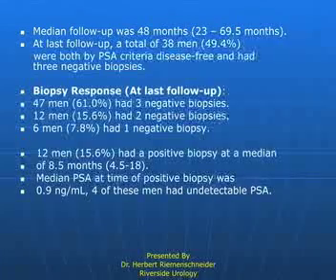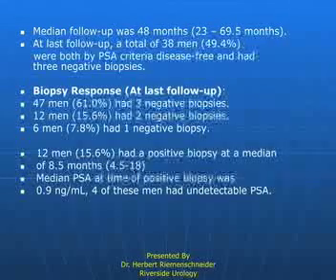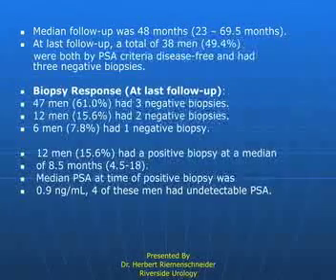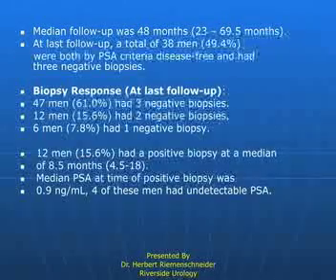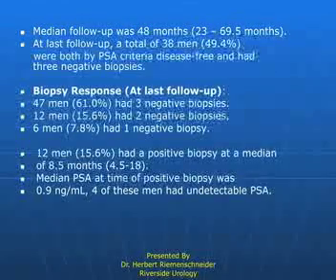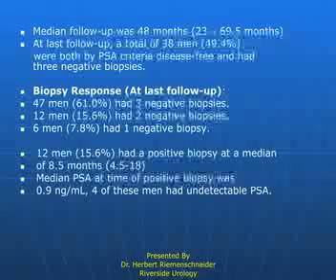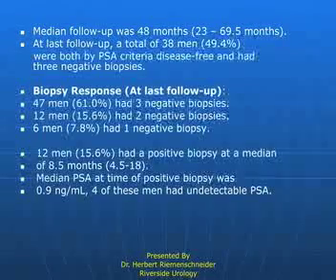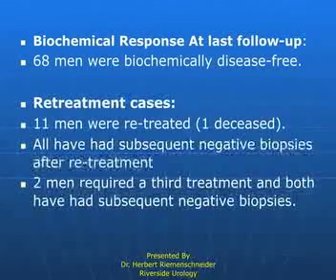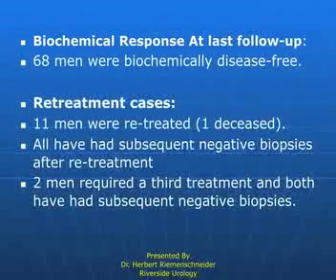The diagnosis was early and therefore gave us the opportunity to treat these patients promptly. And it is interesting that actually the biopsies were positive before the PSA was, which is somewhat counter to the current methods of judging success or failure of cryoablation, which for the most part is done biochemically. Most of our patients that failed actually had a PSA that was less than 1, and in many circumstances, for other ways of follow-up, that would be considered within the normal range.